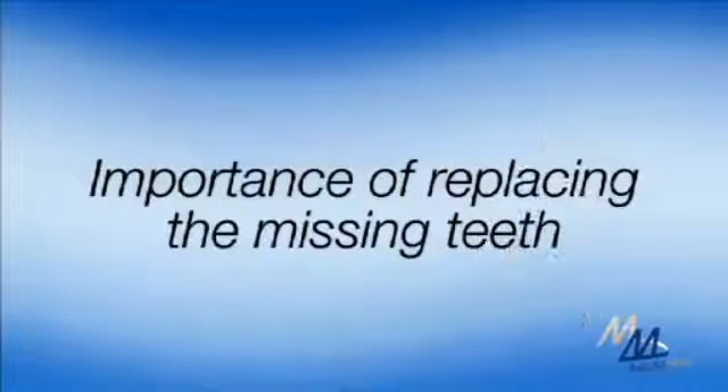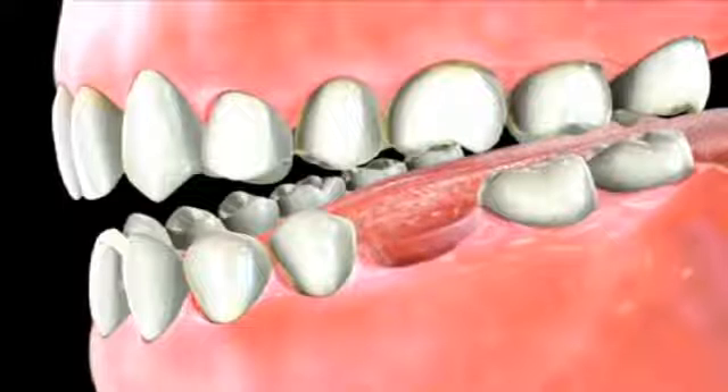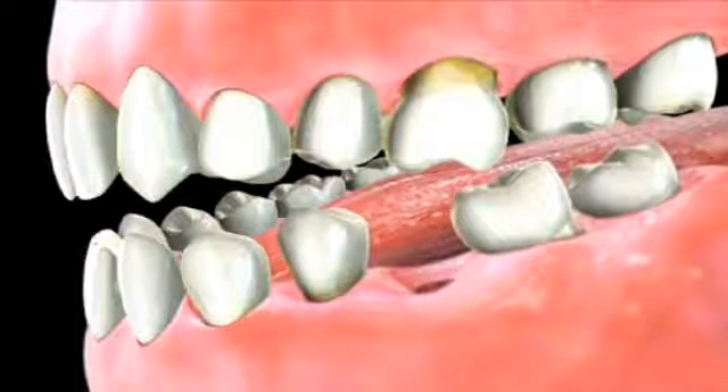Replacing the missing teeth will restore your ability to properly chew and speak, besides its cosmetic advantages. In addition, the space caused by the missing teeth may allow the surrounding teeth to shift into that space. This shifting could cause a misalignment in your bite that can result in problems with your jaw joint.